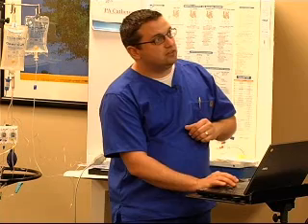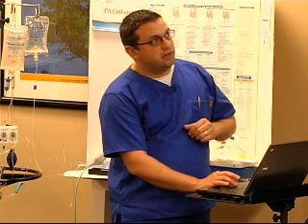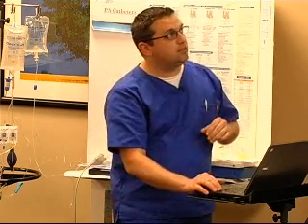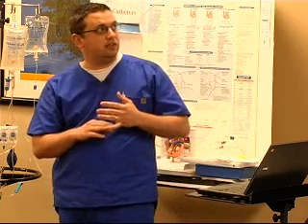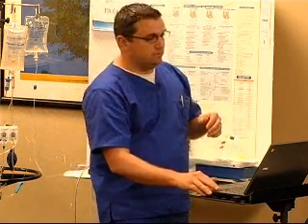Now this one is a better one for that. It shows you this goes from PA and into your wedge waveform, okay? There's not a whole lot of respiratory movement in this one, but nonetheless. And again, like we were talking about with the cardiac output, making sure that you have that quick, steady upstroke, and you're looking for a smooth decline, hopefully not too far out before it returns to baseline. That's an example of how well your heart's pumping.